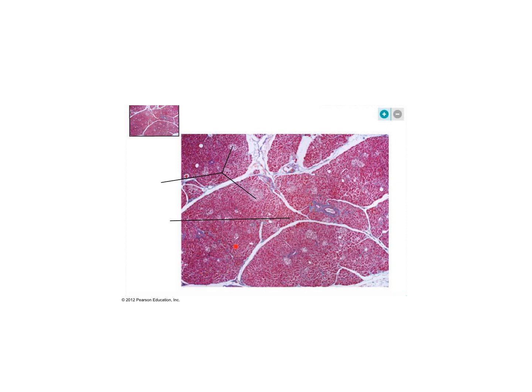But if you see around here, areas within the darker colored tissue are islands of cells. These are called islets, also known as the islets of Langerhans. The pancreatic islets contain the alpha cells and the beta cells that produce glucagon and insulin to regulate your blood sugar levels. So this line, which splits into right here and here, those are the pancreatic islets. This line is pointing to the darker cells, which are the acinar tissue.